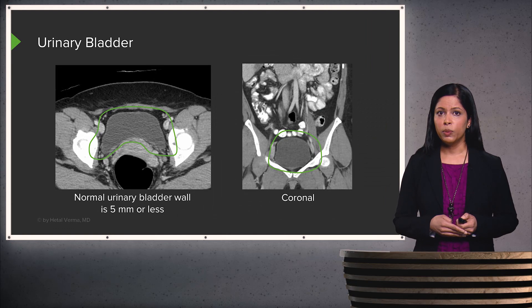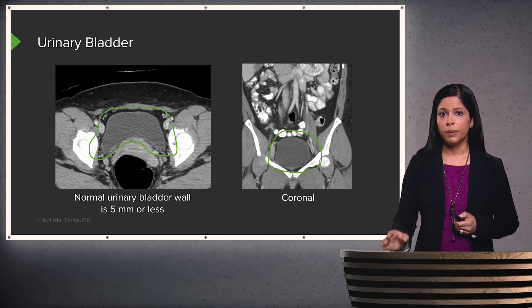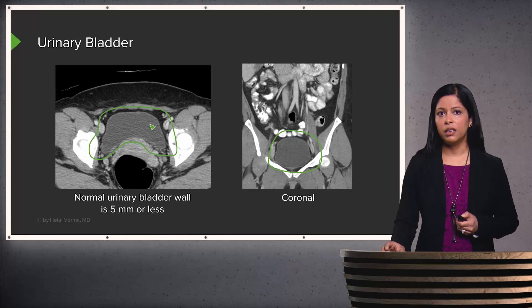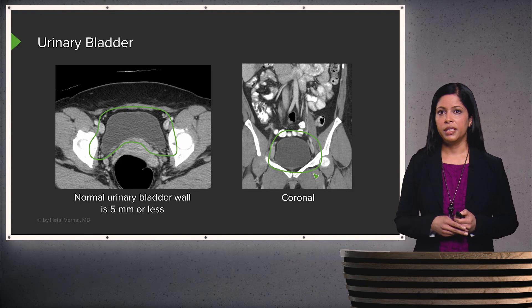The urinary bladder is seen within the pelvis as a fluid-filled structure. The wall is usually about 5 millimeters or less, visible on both axial and coronal CT scans.